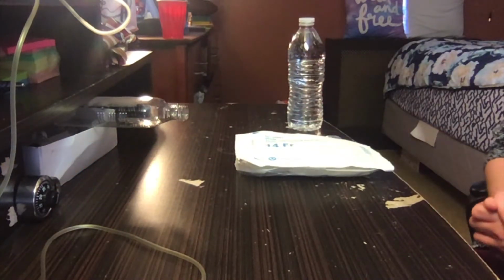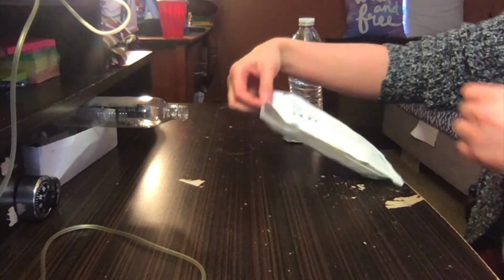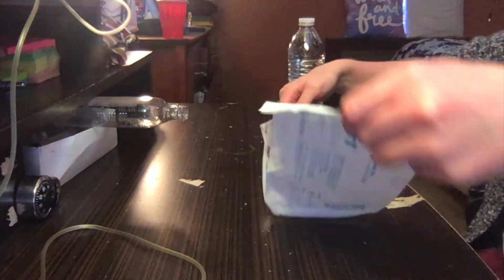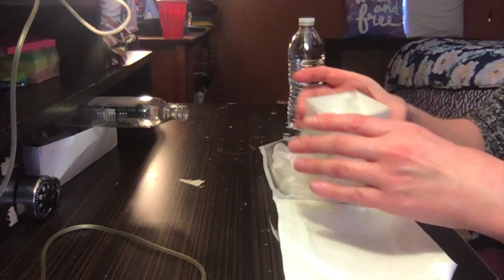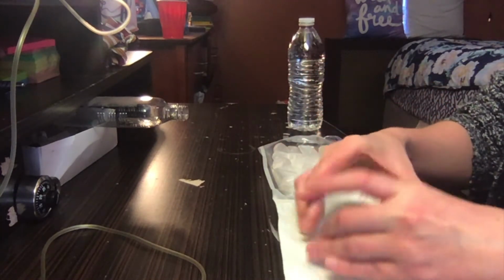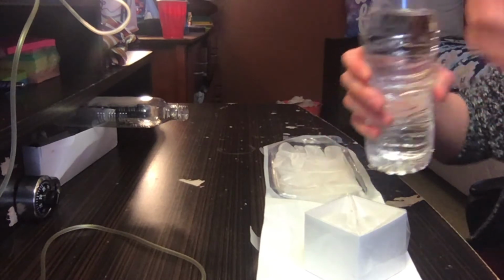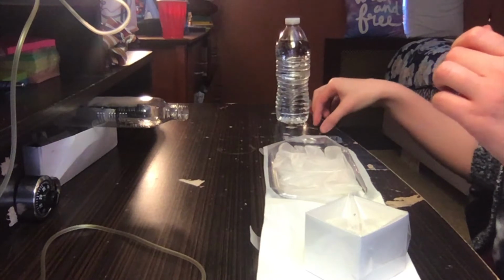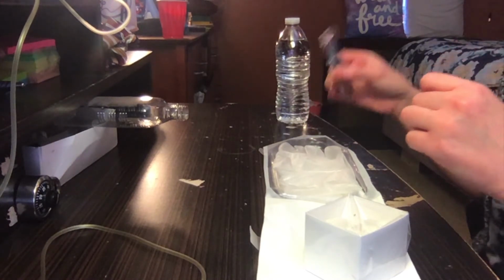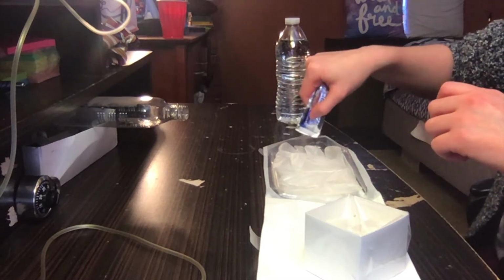Next, I'm going to gather my equipment. You want to open up your package using aseptic technique first. Then you want to open up your basin and place normal saline water into it. Then you want to open up your lubricant, being careful not to touch the package because this lubrication is not sterile. You want to put it into the packaging here.